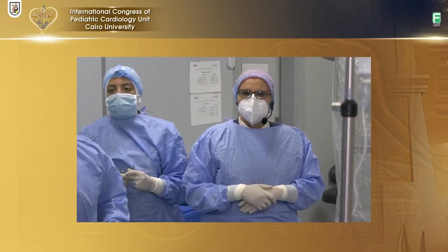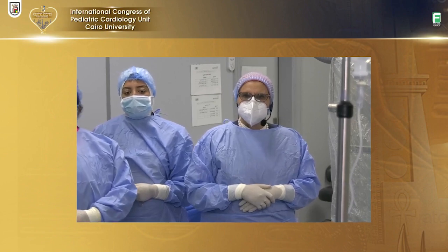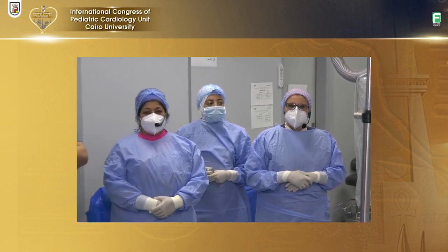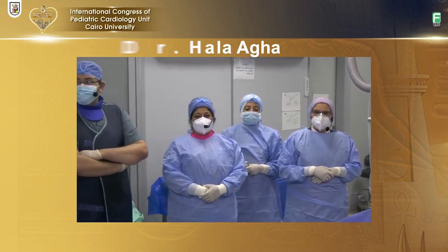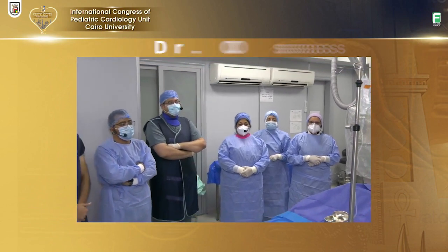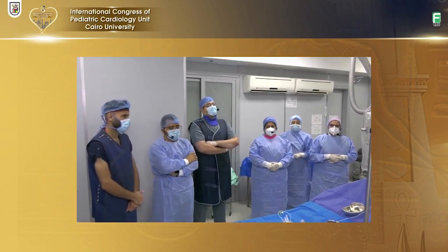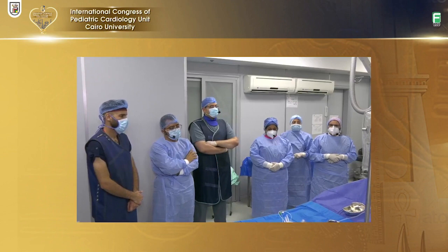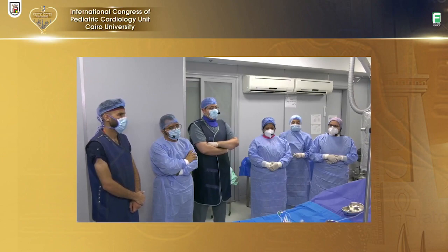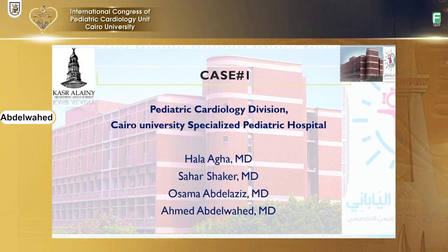Hello everyone, we are here in a cath lab, Pediatric Cardiology Division, Cairo University. We will present one of the interesting cases with a large ASD, me, Hala Agha as operator, and Dr. Sahar Shakir, Dr. Osama Abdelaziz, Dr. Ahmed Abdel Wahid, and our great team, Dr. Dua from the anesthesia team, and Sahar, our nurse, and Muhammad and Rami, our technicians. Now we will present our case.